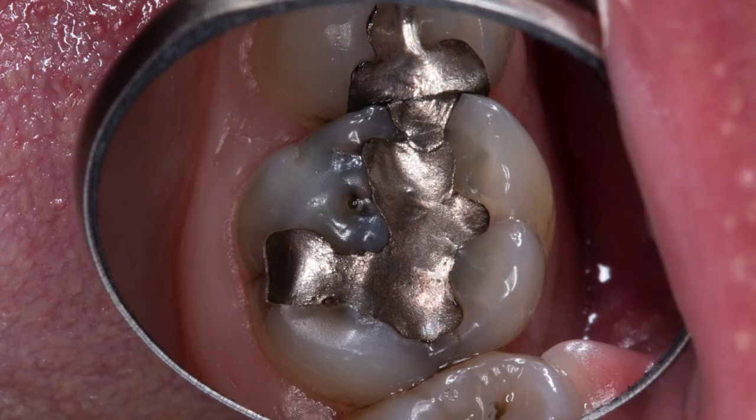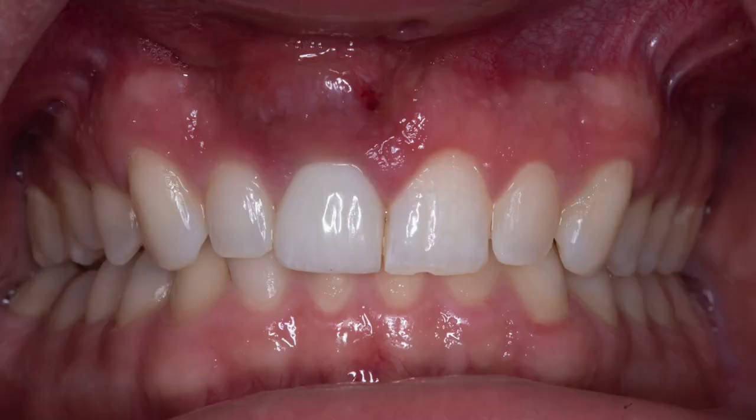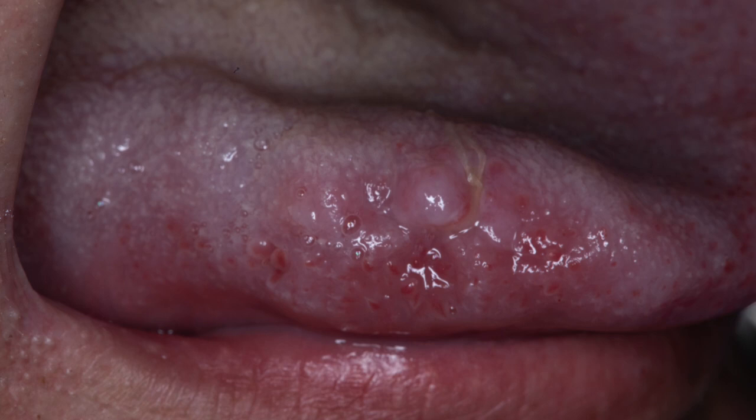These are images I take for particular situations. For example, if I treat a patient restoratively and I find a crack in the tooth, I may take a photo of the tooth that allows me to show the patient the crack. Another example could be taking a picture of an abscess or an oral pathology that I discovered. These are just very specific shots of things that I want to capture.